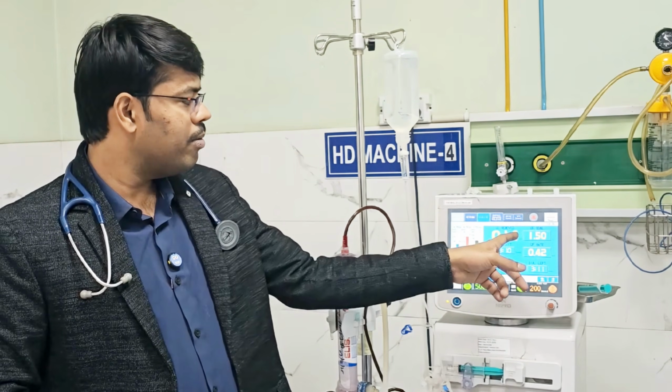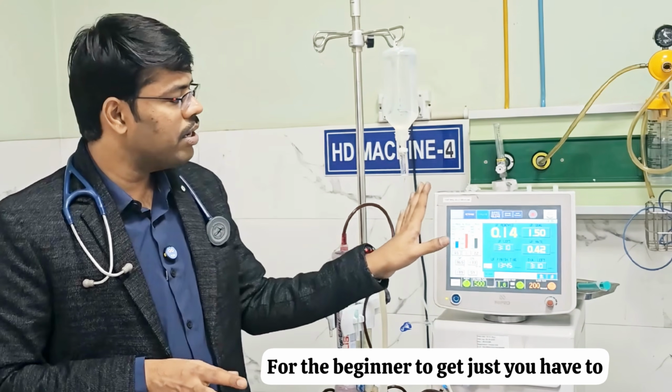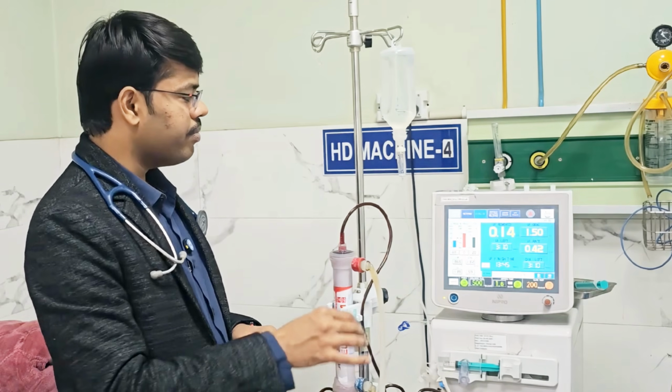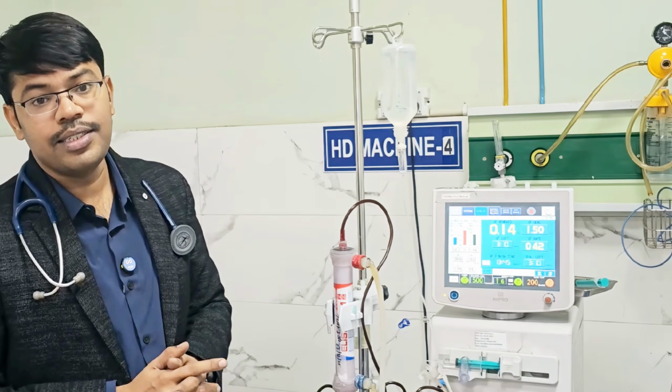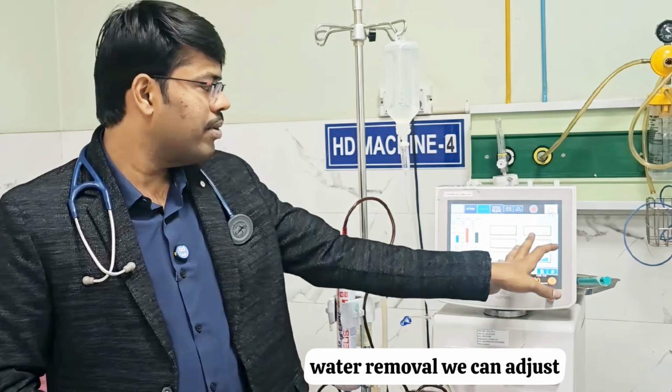In the screen, 1.5 liter is the goal. For the beginner, you just have to set only the gross parameter. These are the next level. Next level are those details which are required for a dialysis technologist and the nephrology resident. Ultrafiltrate profiling. Water removal we can adjust.